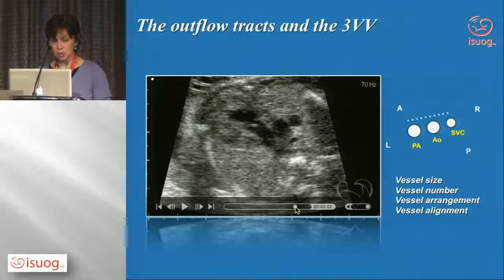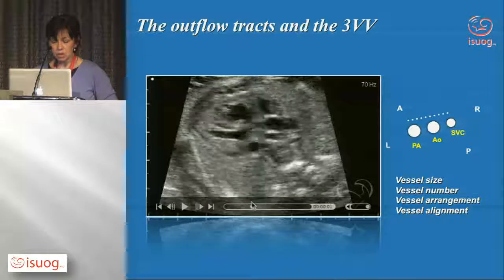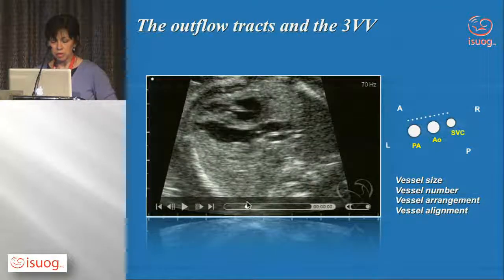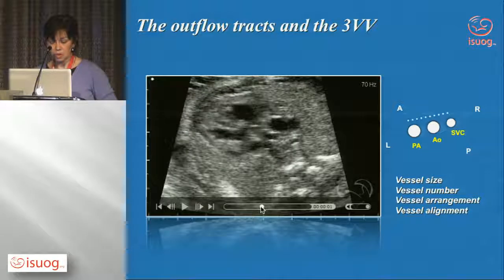Just include that on, it's not on our guidelines yet, but maybe the next one will include measurements. So that's the right ventricular outflow tract. This is the aorta, and so don't just memorize that that's the aorta. Go back to your clip and you can see the aorta coming off the left ventricle, and if you keep an eye on here, you can see that that will become the aorta in short axis view.